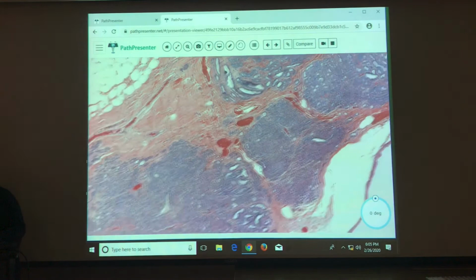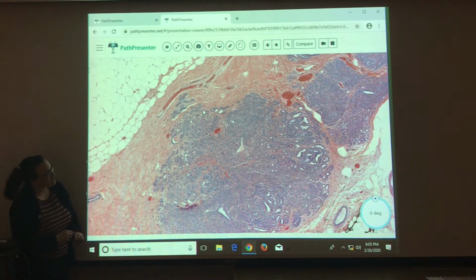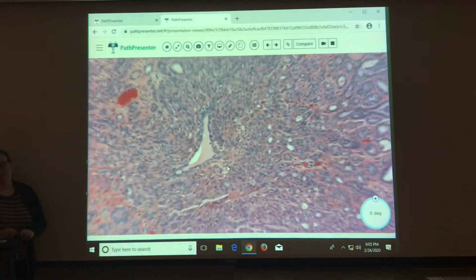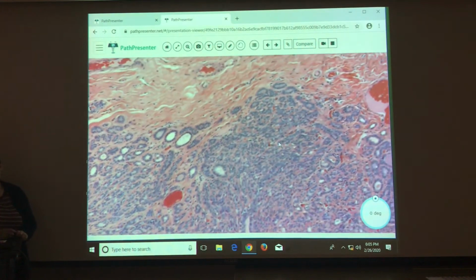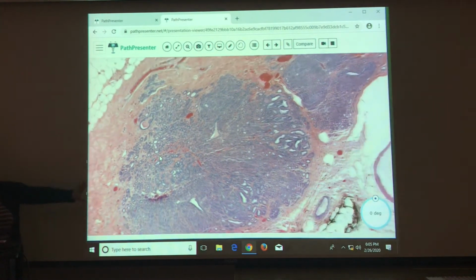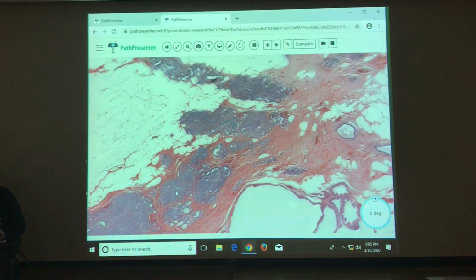Okay. And these ones down here are beautiful examples, so just low power. Look at the overall architecture. If this is your center point, how does everything else look in relation to that? Again, easiest to see at low power. It's like radiating, kind of swirling around it. Like this one and the one right at the bottom, those are probably the best examples of it on this slide. That's something that kind of helps you out.